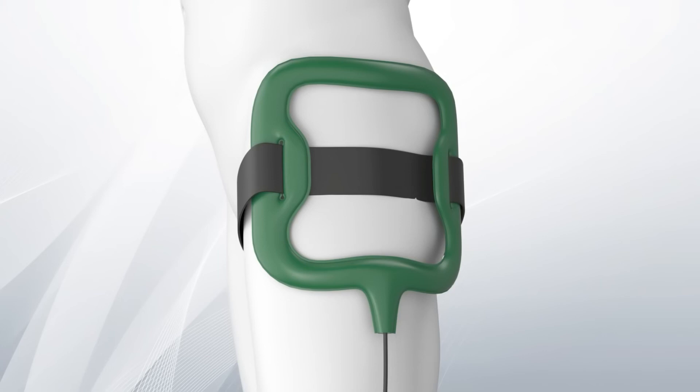Biostim SPT can be used even in the presence of a cast, braces, bandages, and through clothing.